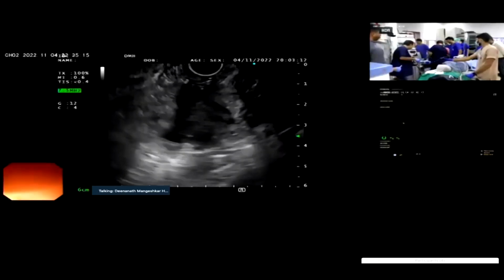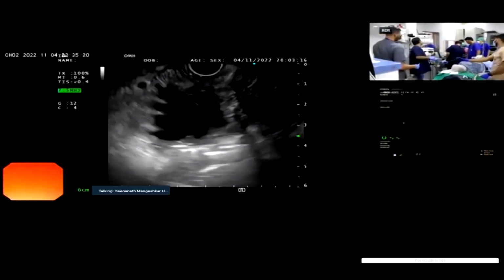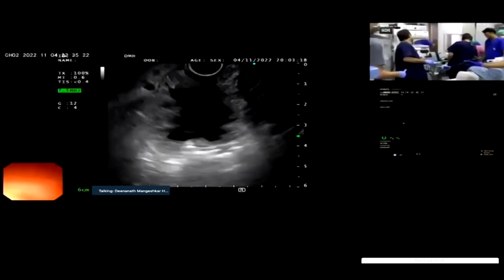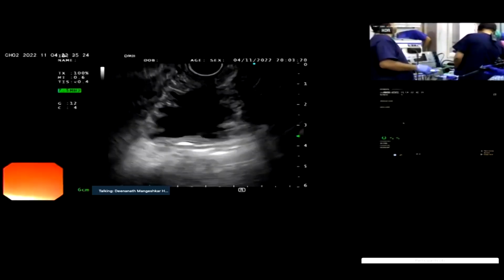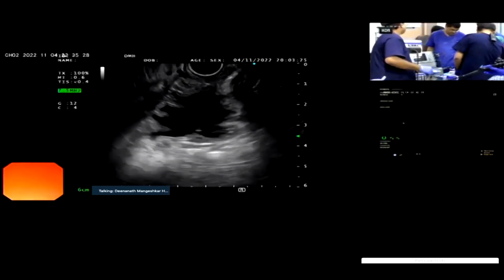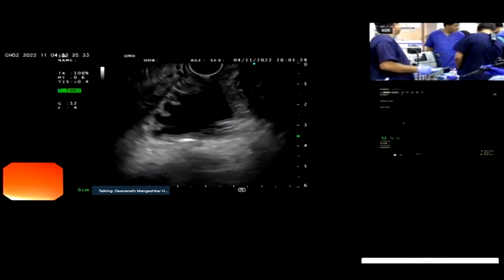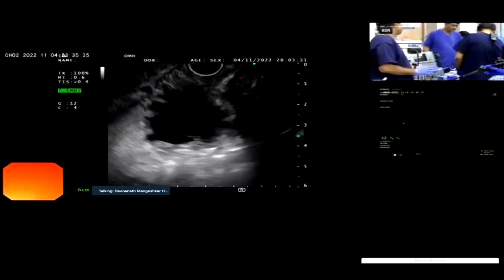When you do cytology, you need to get ROSE. But when you are getting an FNB with the current kind of needle, like the Acquire needle, using macroscopic evaluation will give you a good estimate of the sample that you have collected in your needle specimen.